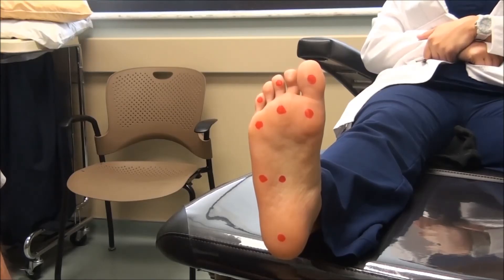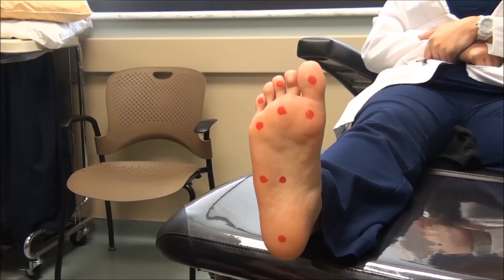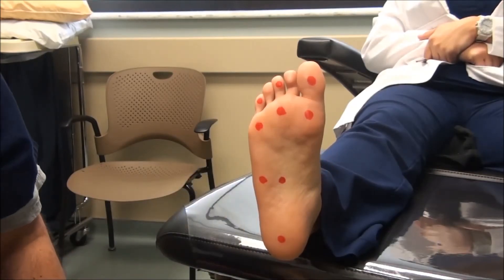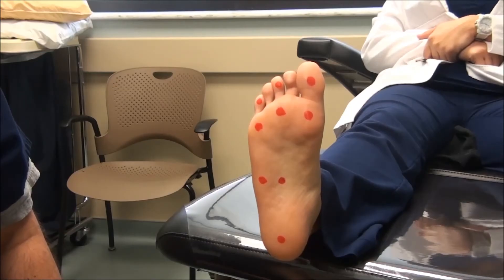A positive test is signified by greater than four out of the ten points being insensate. The test is simply performed by taking the monofilament and pressing it against the skin until it just begins to bend. Ideally you'll want the patient to demonstrate a yes or a no if they feel the sensation.